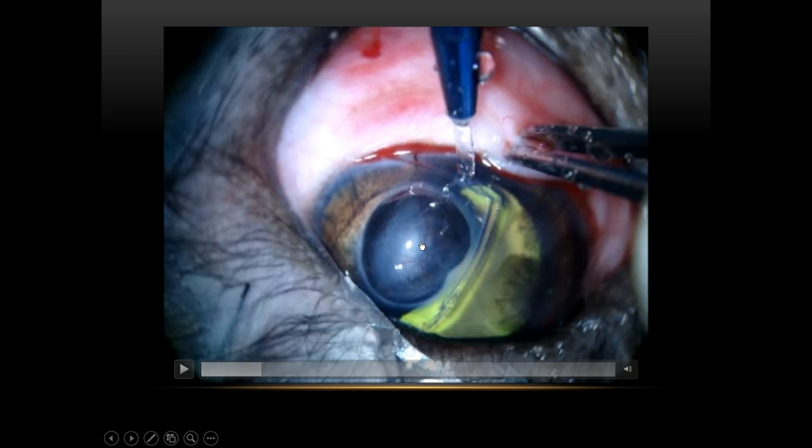So in order to restore the full thickness of this part of the eye and give the dog very good transparency in this region, right by the visual axis, the best procedure in this case is corneal scleral transposition. Okay, so this is the best transparency you're gonna achieve. This is more tricky. It is a more advanced technique than the former one that I showed you guys.